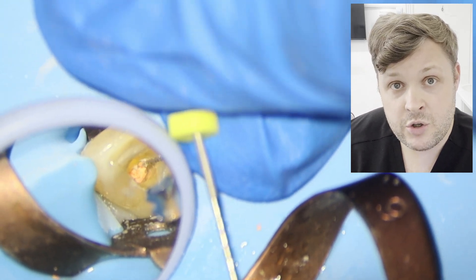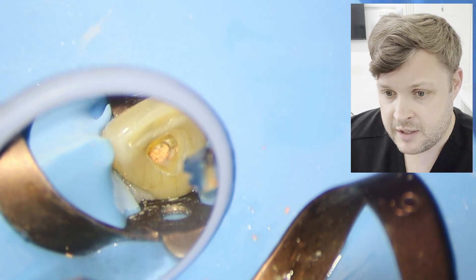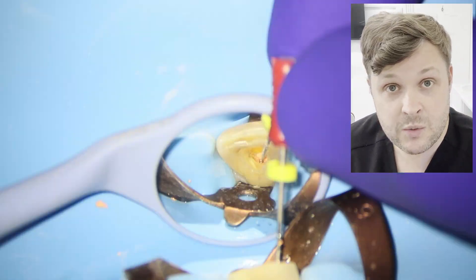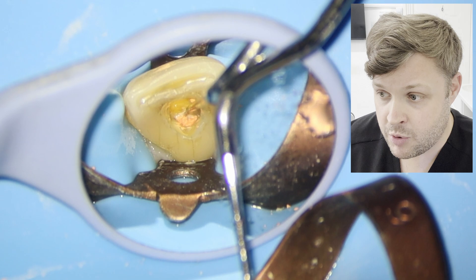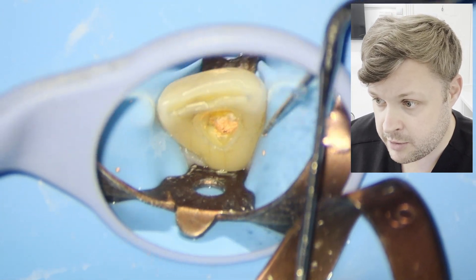The problem with using rotary files is they can destroy the GP — you can't remove the whole GP in one piece, and that's what you want. You don't want to break it up into little pieces. So I'm very slowly picking away at the coronal portion of the GP with a DG-16 endodontic probe.